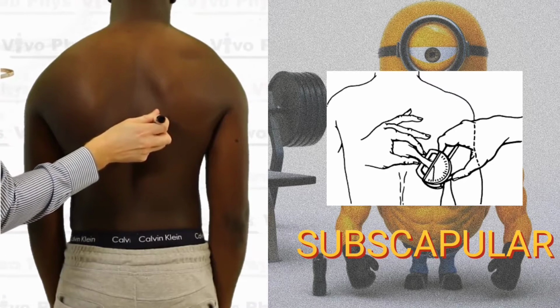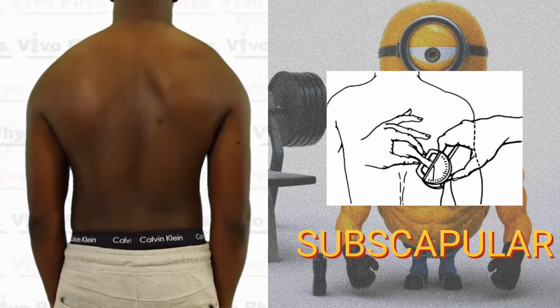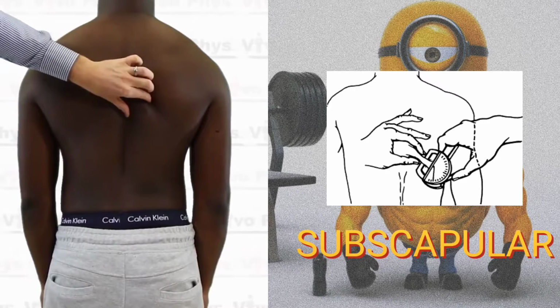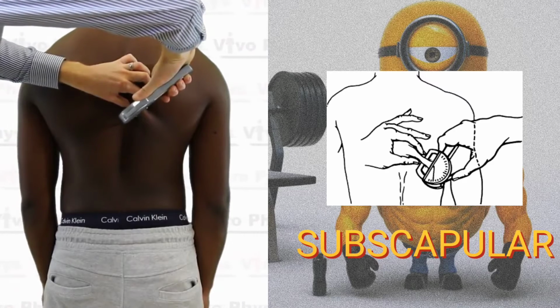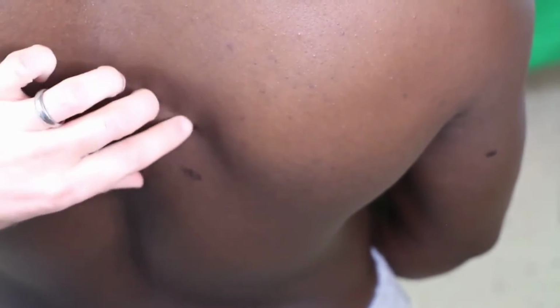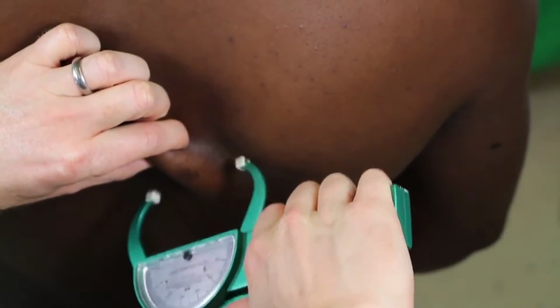Make sure though that you have the person relax their arm back down, and when they relax their arm, you're going to see the scapula come down, so you need to just trace with your fingers as that scapula is moving back downward to its resting position. Once you find the appropriate site on the scapula, you're just going to go about 1 inch or about 2 centimeters down and out away from it in a diagonal fashion, and that's where the skinfold site is going to be, and this is going to be a diagonal skinfold.